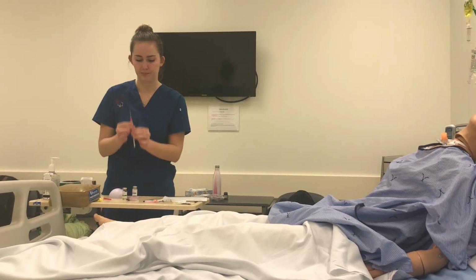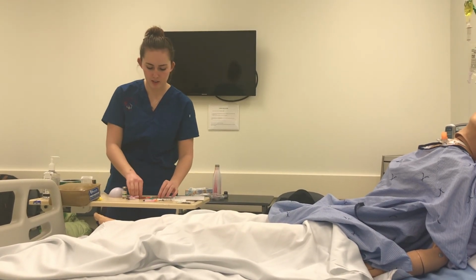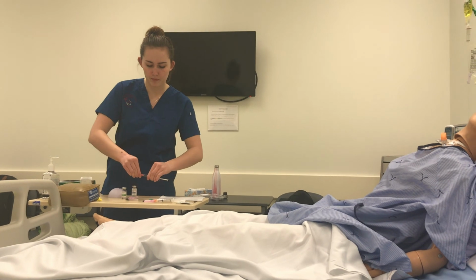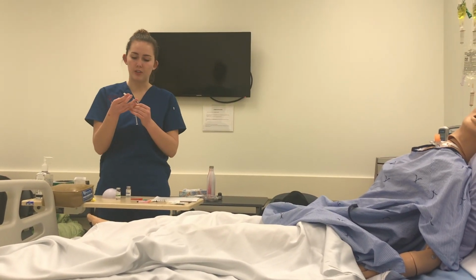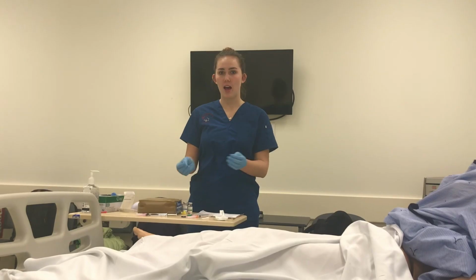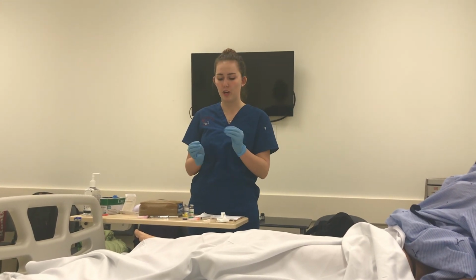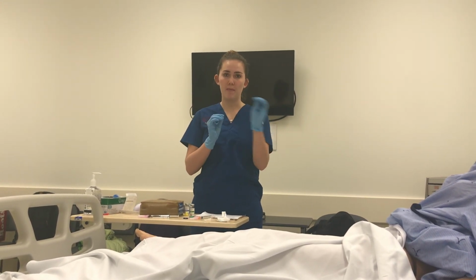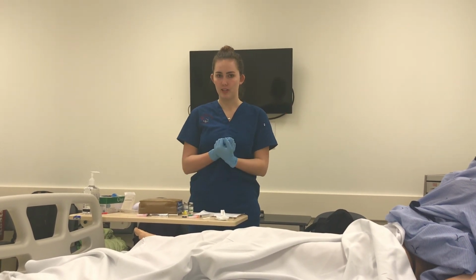Okay. Now I'm going to recap the blunt needle, untwist it, and replace it with a 22 gauge IM needle. I have prepared the syringes with our medication. I would label the medication, what medication it is, and the dose on both of these syringes.